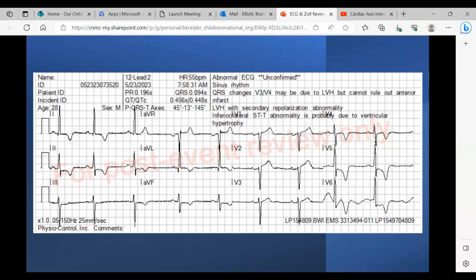So when you first get that 12 lead, does anyone feel fuzzy about it? Like, do I like it? Yes. I mean, all the T waves are inverted, right? So that's a bummer. That's not good. I'm glad that the QRS complexes are narrow because he's not in a ventricular rhythm.